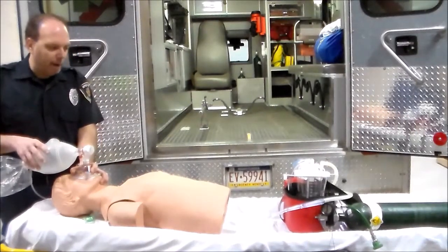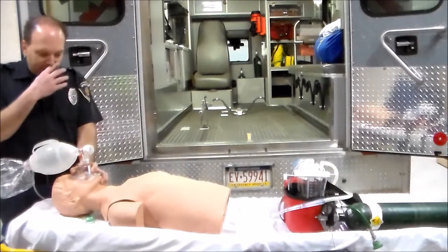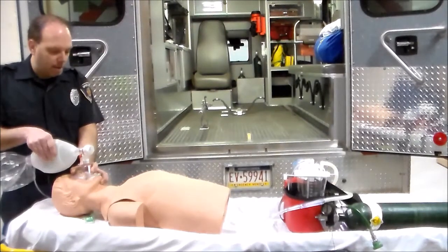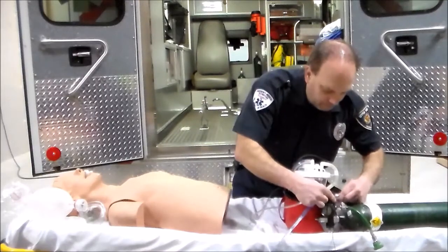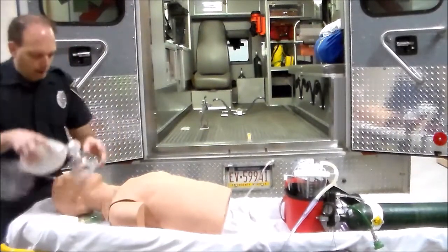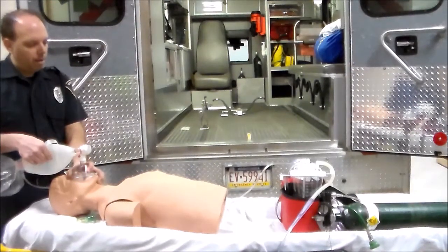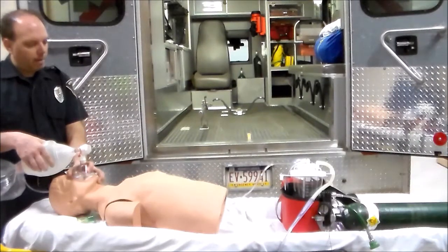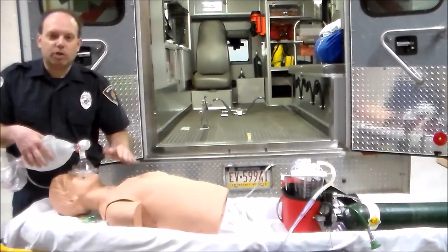I obtain my bag valve mask device, apply the CE clamp technique, and ventilate him one breath every six seconds. I notice that I'm getting great chest rise. I need to make sure I can hook him up to oxygen, so I take a few seconds and apply the oxygen to the BVM.